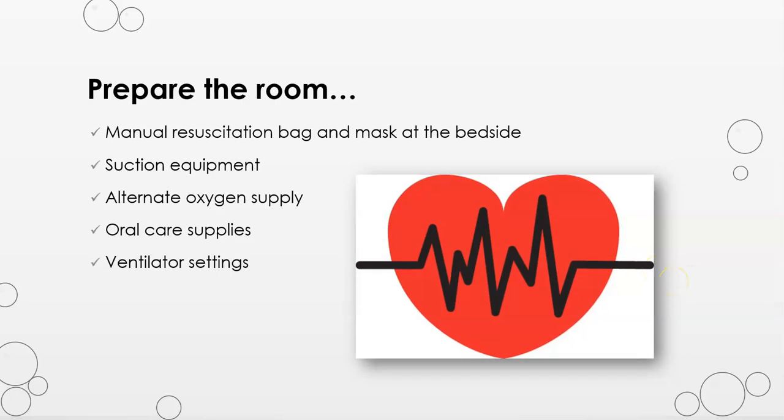Knowing your patient needs to be intubated and ventilated means that the right equipment needs to be at the bedside so you'll have it as you need it. This is especially true of the manual resuscitation bag and mask, should the tube inadvertently be pulled out. Also, if the patient codes, the bag will be there to manually ventilate the patient. Keep a portable oxygen tank under the bed or somewhere in the room, lest you need an alternate source in case of emergency. The machine should be plugged into the emergency power source receptacle should power be lost unexpectedly. They are typically red power receptacles. The nurse also needs to be aware at all times of what the last ordered ventilator settings are and to verify that by checking the machine.